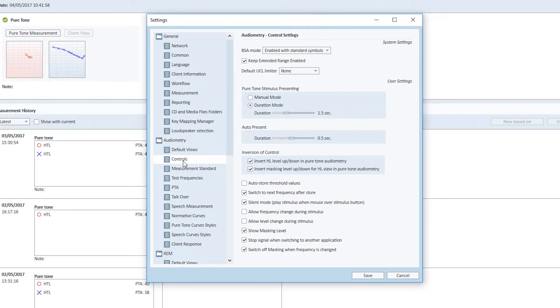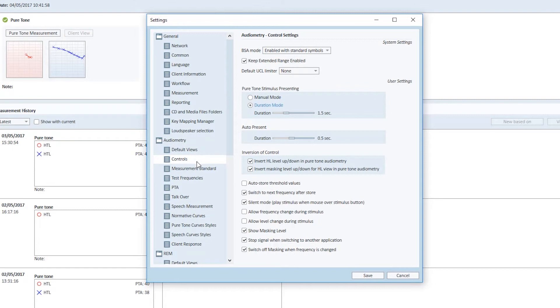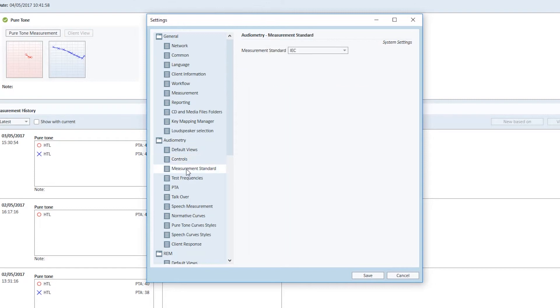You can select Keep Extended Range Enabled, Manual Mode or Duration Mode, Switch to Next Frequency After Store, Switch Off Masking After the Frequency is Changed and several others. You can also configure the test frequencies.